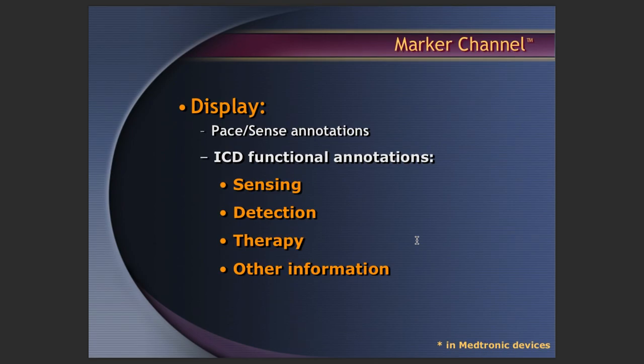So there are different components as well, what you call the marker channel. The marker channel's role is for the display, in fact.